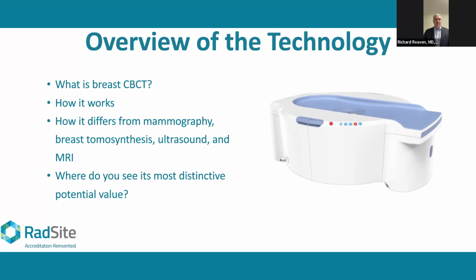Now, it may be kind of confusing, and so I'll try to explain it to you. One of the things that has come out in the past 10, 15 years is what's called 3D mammogram or tomosynthesis. It's really a misnomer, and it's not actually three-dimensional technology. What it really is, is an X-ray, which is a single shot, and it spins the detector about 15 or 30 degrees this way and 15 to 30 degrees that way. It doesn't go all the way around.